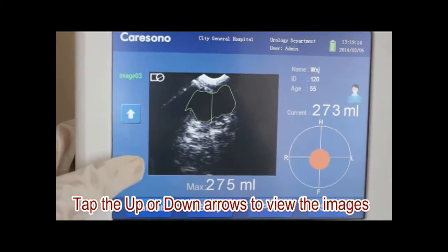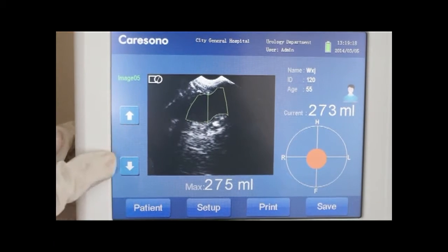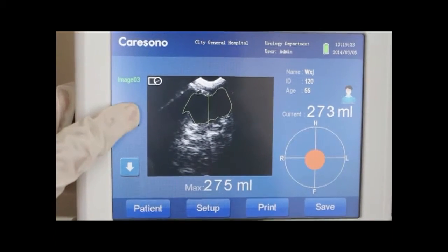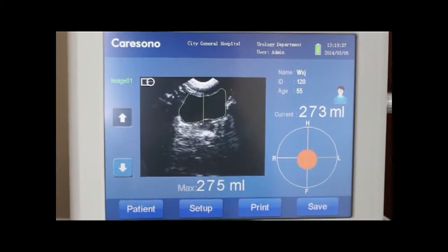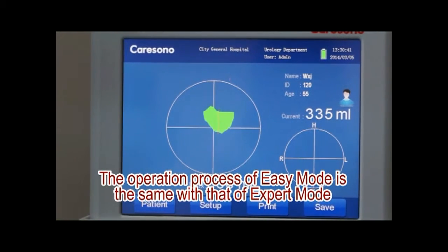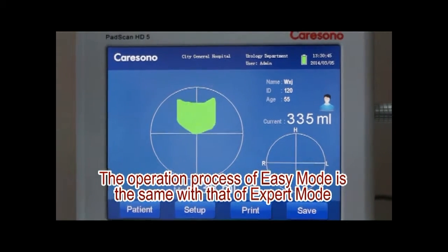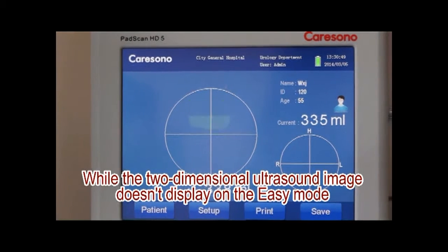Tap the upward-down arrows to view the images. The operation process of the easy mode is the same as that of the expert mode, but the two-dimensional ultrasound image doesn't display on the easy mode.